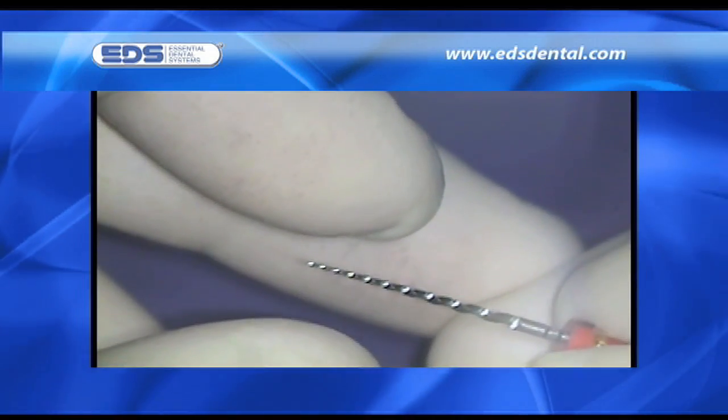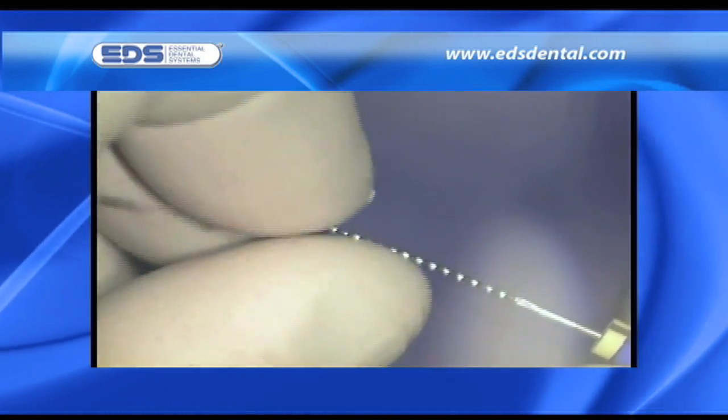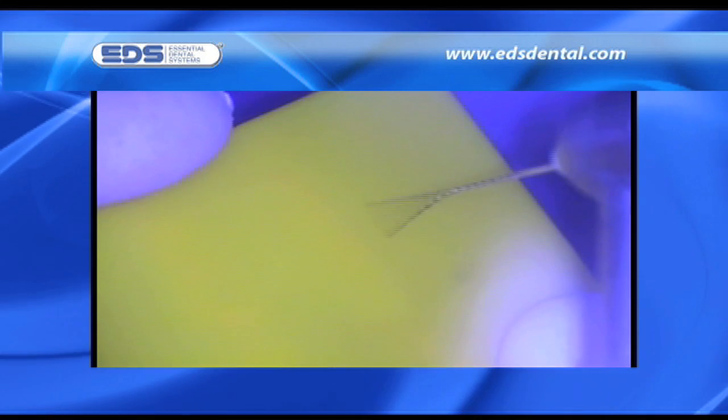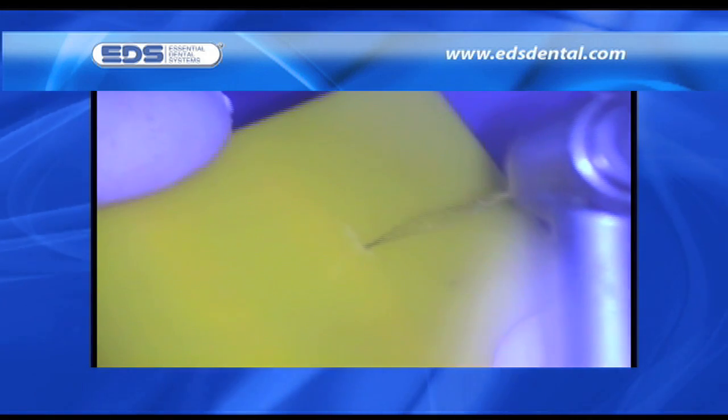Another significant observation is the snapback property of NiTi. This is not an advantage because it tends to selectively shape canals to the outer wall. Compare this snapback to the recording of a curve when a deforming pressure is applied to stainless steel. One might think that an instrument recording a curve would distort the apical preparation of a canal. However, as this video clearly shows, once the tip of the instrument is confined by a solid object, the tip becomes a point contact with the arcing of the instrument transported more coronally, helping to shape the canals to a greater diameter exactly as desired.